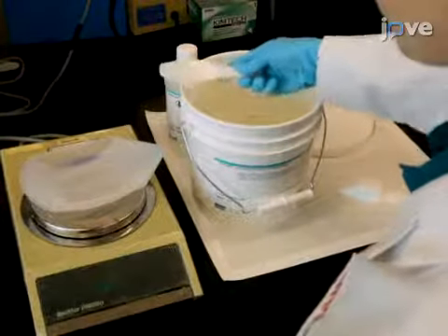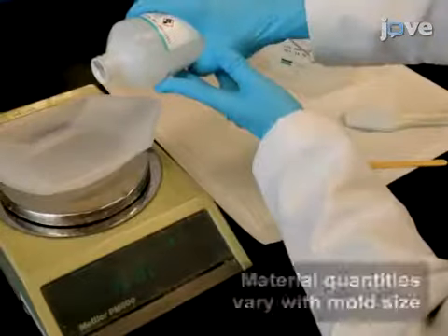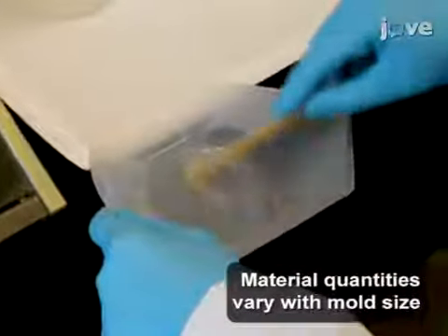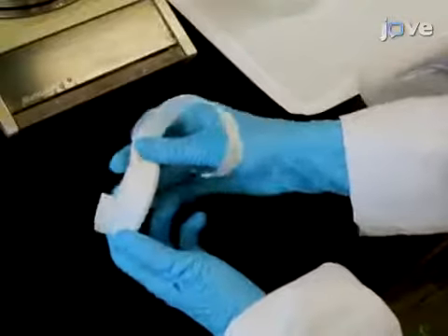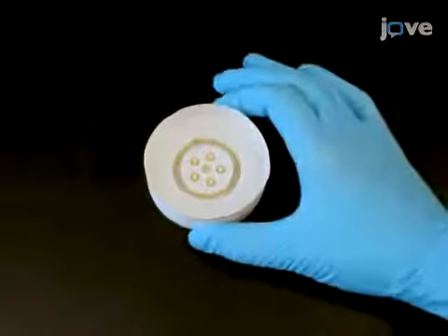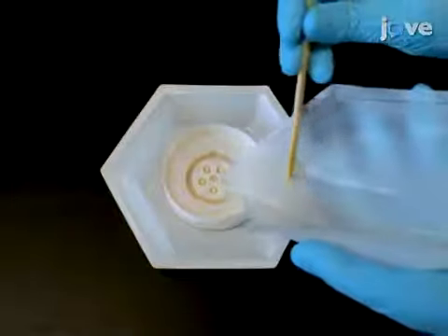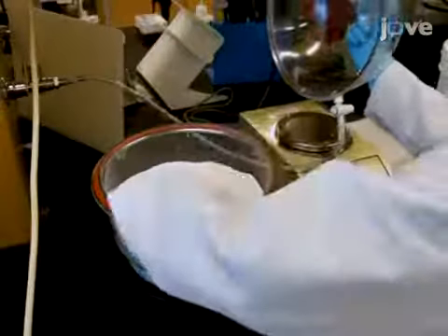Next, measure 25 grams of PDMS base in a disposable weighboat. Add curing agent in a 1 to 10 ratio by weight and stir vigorously until the base and curing agent are thoroughly mixed. Then, fix laboratory tape around the sides of the mold to form a wall about 1 cm high around the face with the printed wells. Ensure that there are no gaps in the tape wall. Pour the PDMS mixture into the 3D printed mold. De-gas the PDMS in a vacuum chamber for 30 to 60 minutes or until no bubbles remain.